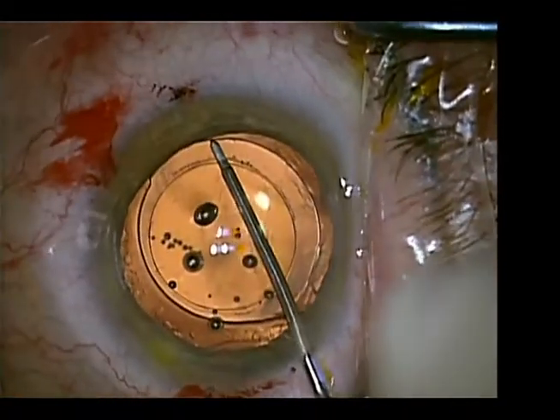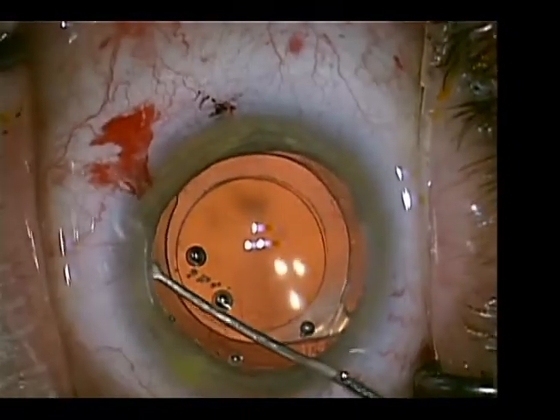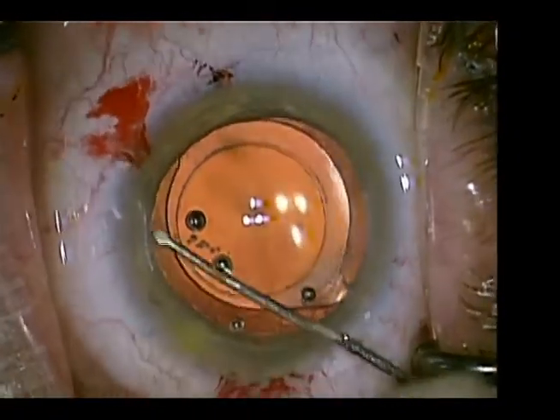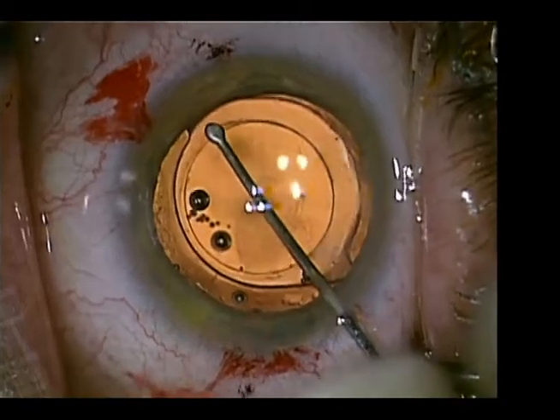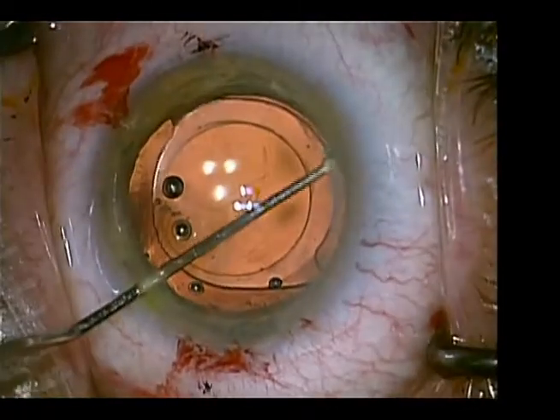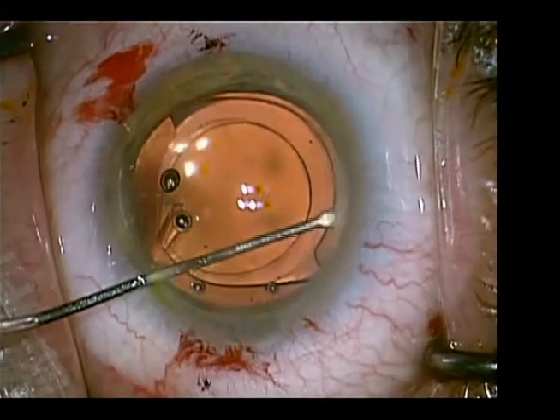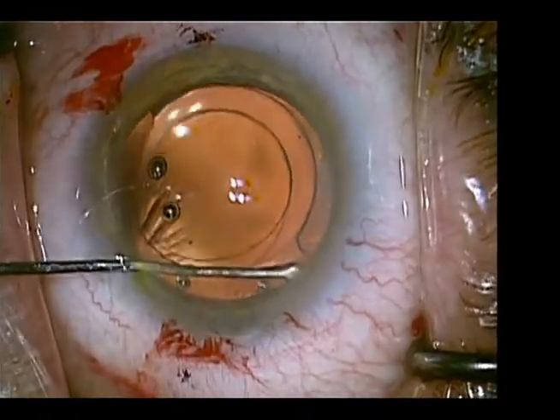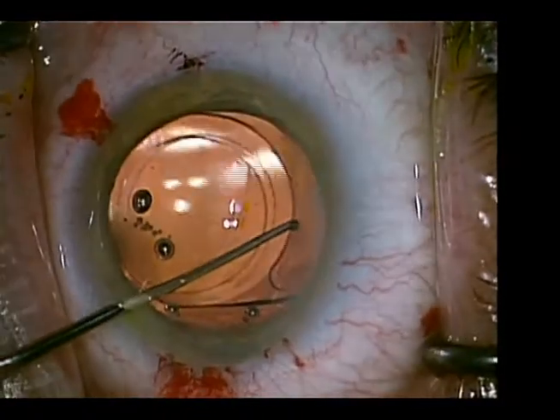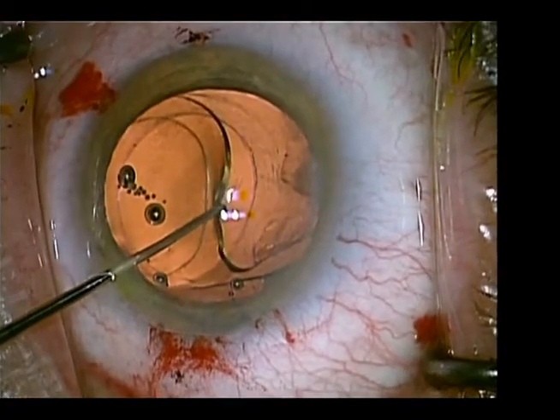A Donnenfeld spatula is used to separate the anterior capsule from the underlying anterior surface of the IOL, and then with blunt and visco-dissection, the capsule is separated from the anterior surface of the lens for 360 degrees.